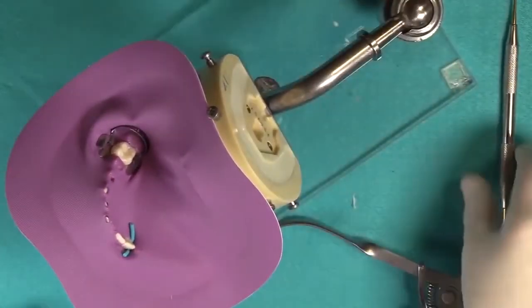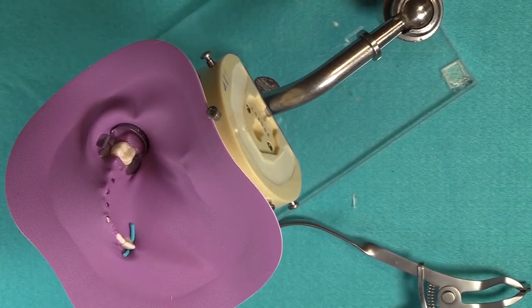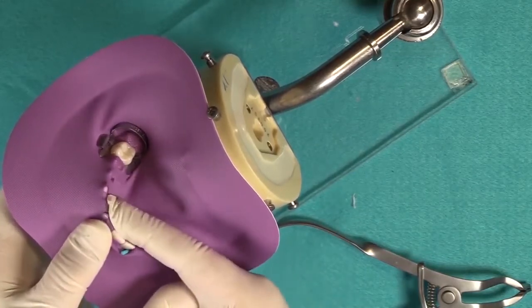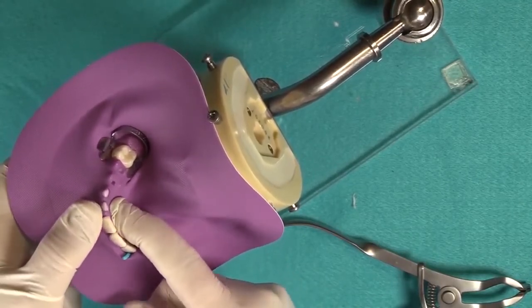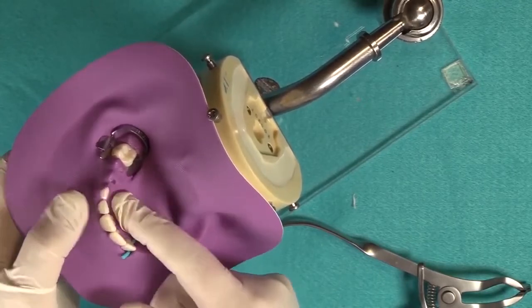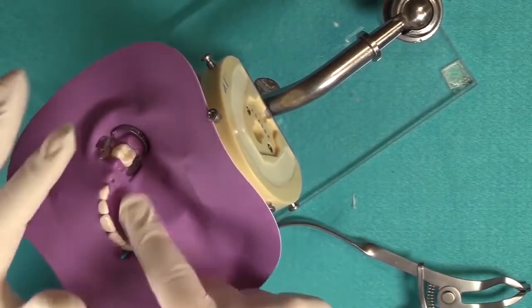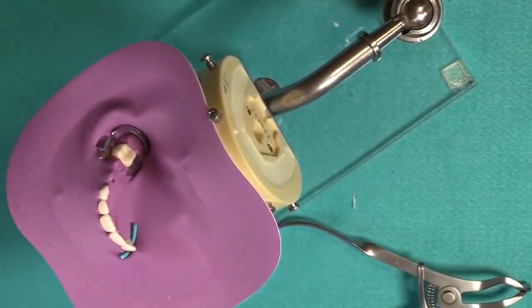There we go. Now, usually what happens, individuals have problems getting the dam between the teeth. And that's because they try to bunch it and force it through. Well, and probably if they're not lubricating it, that's going to add to the difficulty. Exactly. So what I'm going to show you is called the knifed edge concept. What it is, I'm taking this edge and I'm going to line it up and bring it through the contact. So I see how you're using your fingers to stretch it thinner. Stretch it thinner and bring it through. Now, where the contacts aren't too tight, this will work perfectly. But back here, if you notice when I was testing the floss, I had my tighter contacts here, which is normal in most people anyway.